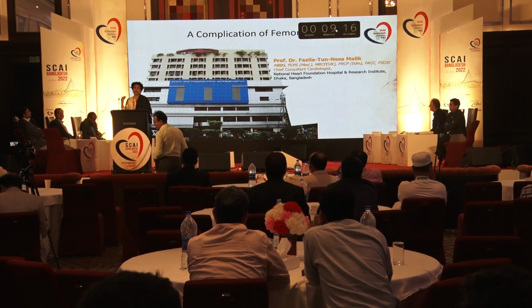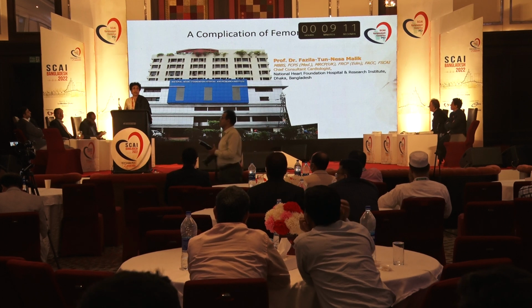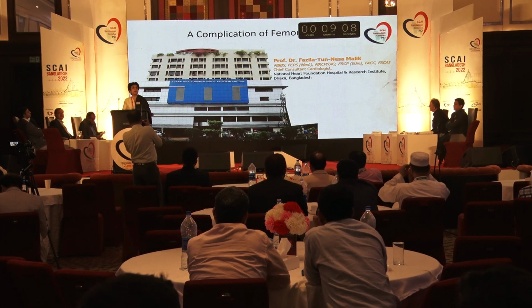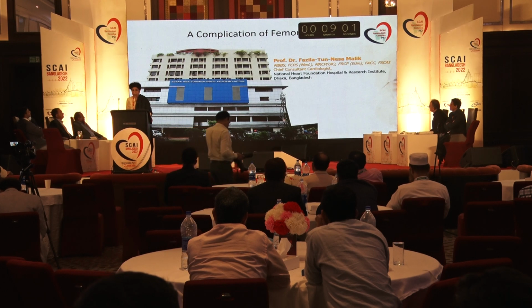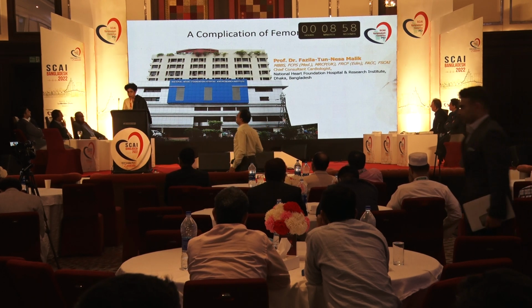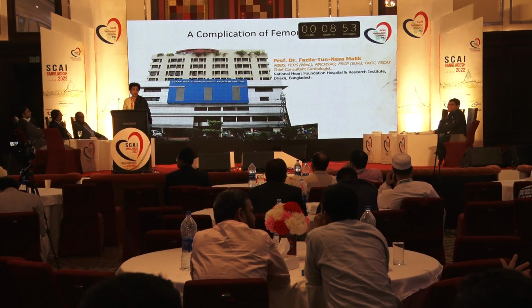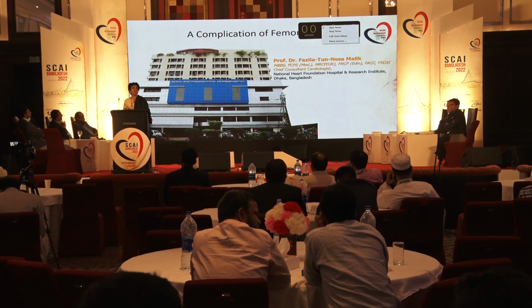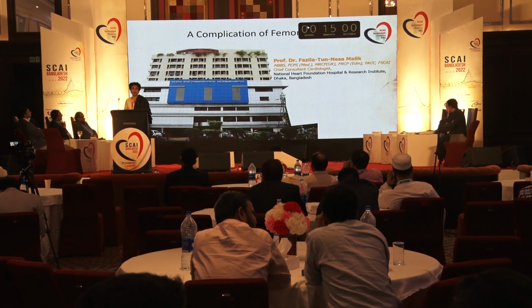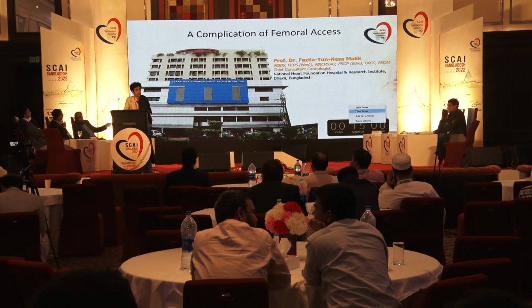So the first rule should be that we should not have any complications. We should do the procedure so well that we do not have any complications. And for that, obviously, you have to choose your site, either angiographically or by Doppler, but make sure that you're puncturing the common femoral artery, not below or high up, and that should be the trick. Now, what else do you need to do? If your patient is hypertensive, you need to control your blood pressure before you do the puncture. And after the procedure, you need to take proper care of your access site, do proper hemostasis, and only then discharge. But still, even after the best possible measures, complications do happen.